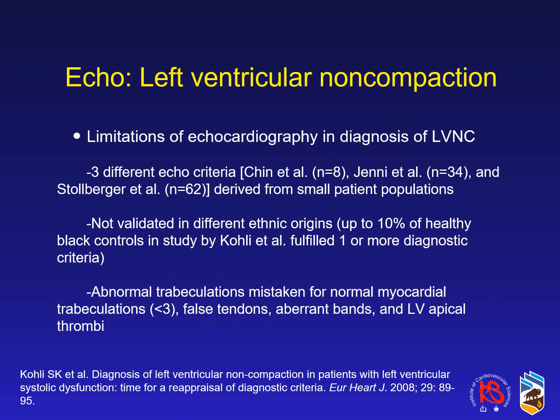Now, one must remember that there are limitations of echocardiography in the non-invasive diagnosis of LV non-compaction. This was a paper published by Kohli and colleagues in the European Heart Journal in 2008, and they commented on the following three key elements. The first is that three different echo criteria, Chin et al., Jenni et al., and Stollberger et al., were derived from very small patient populations. The second is that the criteria are not validated in different ethnic groups. Up to 10% of actually healthy black controls in the study by Kohli et al. fulfilled one or more diagnostic criteria for LV non-compaction.